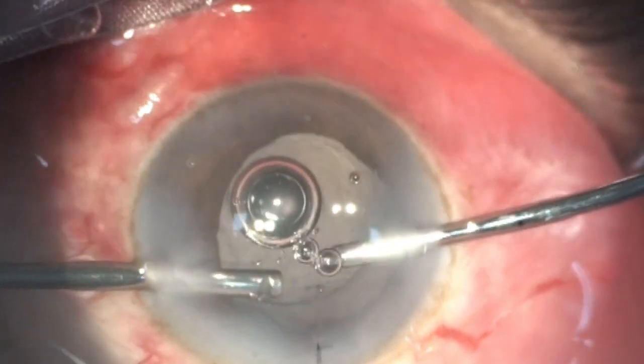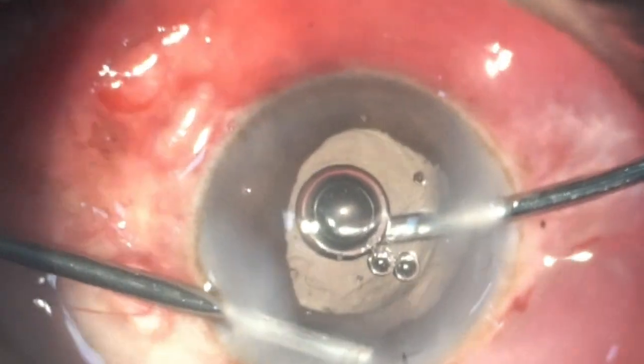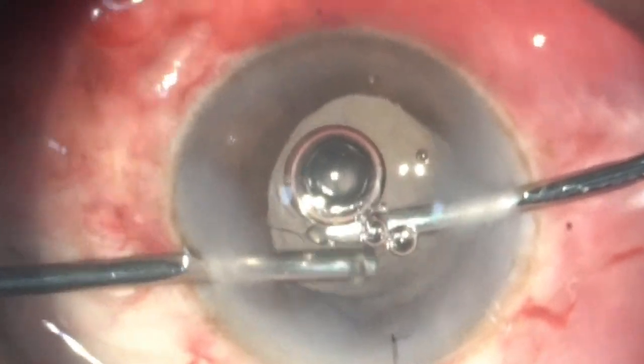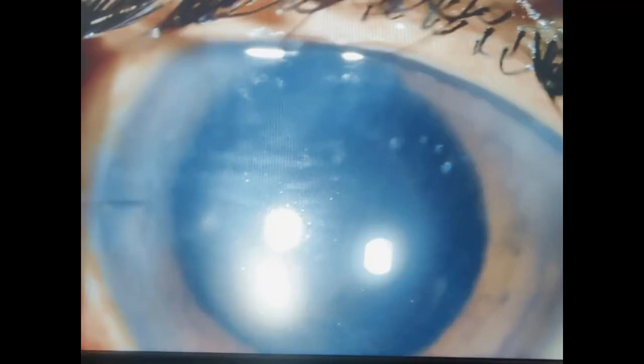Here the take-home message is, first of all, proper placement of 3-piece IOL in the anterior chamber and adequate anterior vitrectomy to take care of the vitreous strands which are causing IOL decentration. And we can see the post-op day 1 picture shows well-centered IOL.